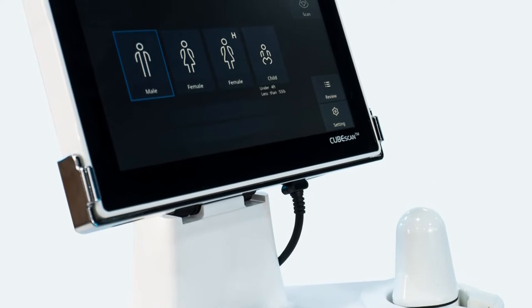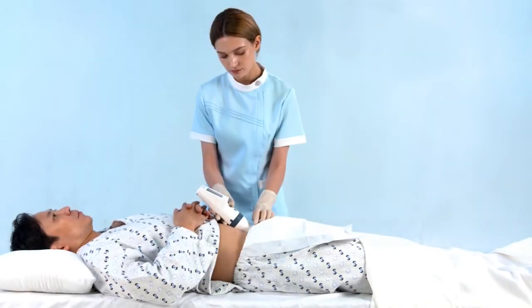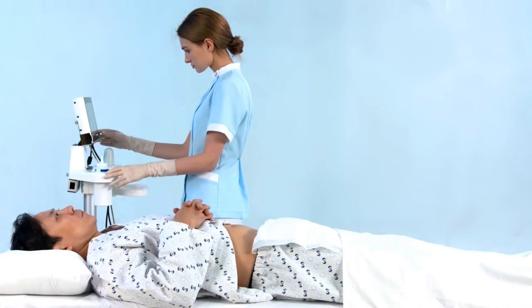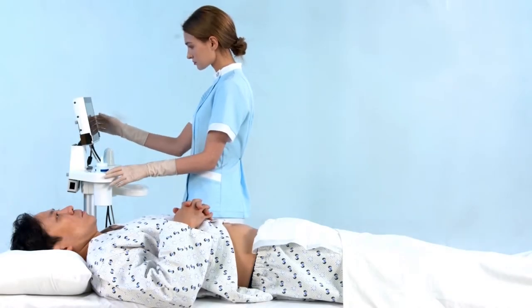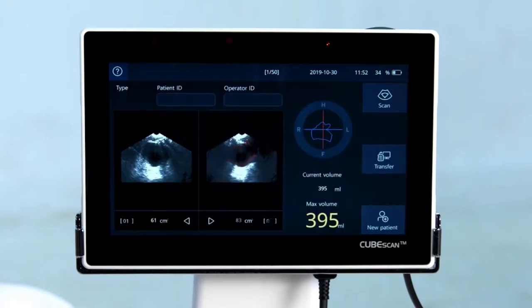Want to make your day easy? Here's the answer. CubeScan Bladder Scanner. The CubeScan Bladder Scanner is the optimized clinical solution for CAUTI prevention and bladder dysfunction.